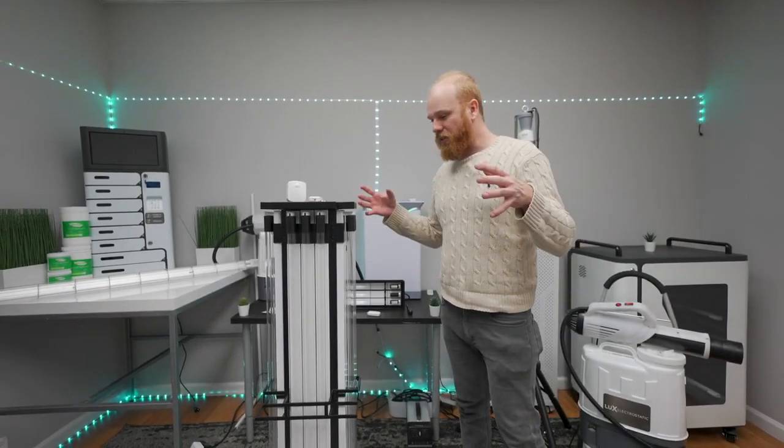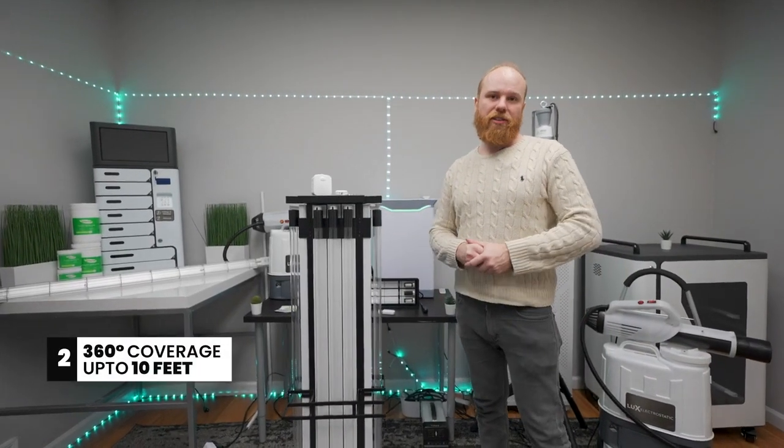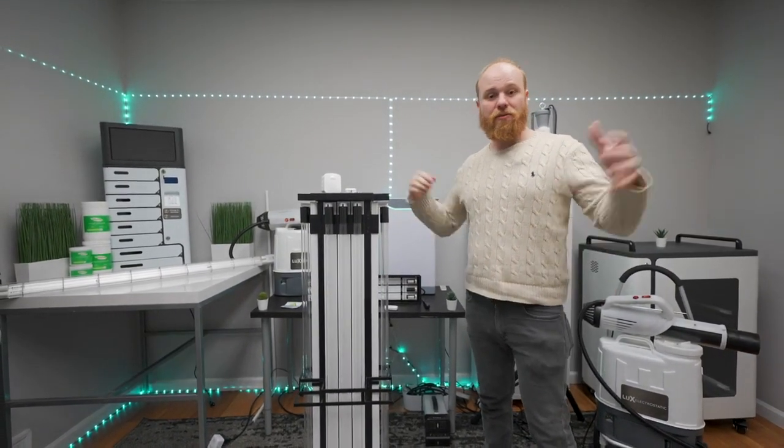The UVC Ultra is unique because it combines this 400 watts into a 360-degree coverage at a radius of 10 feet, creating comprehensive UVC disinfection power for spaces like the room we're in right now.